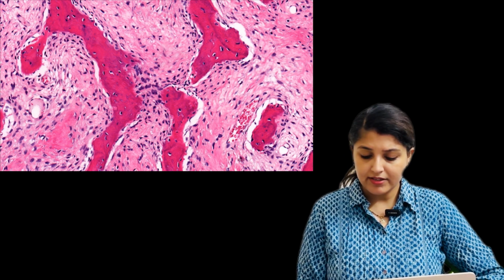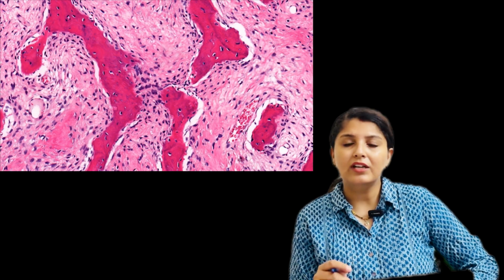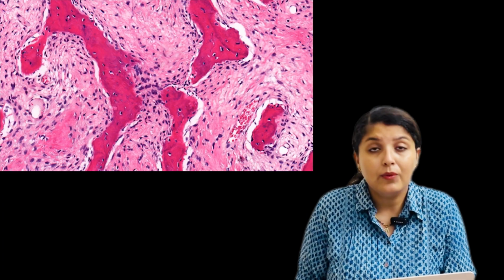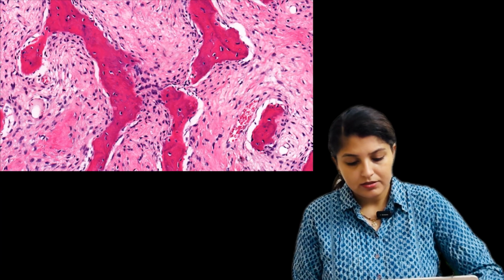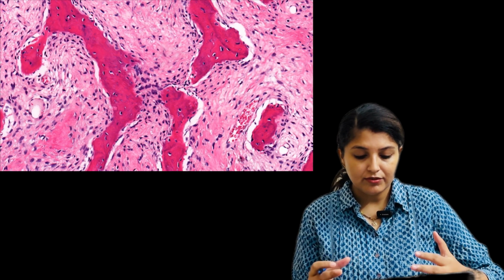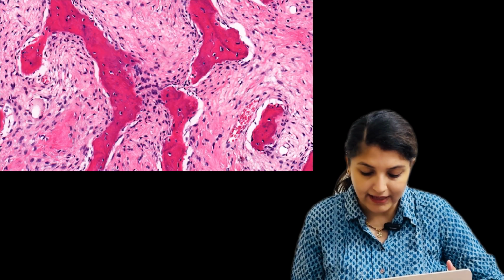Now the lesions are rich in spindle shaped fibroblasts. We have already discussed this with swirled appearance. Okay, one more thing we need to keep in mind: the fibroblasts will be seen in a swirled appearance within the marrow spaces. Fine. Now coming to the hallmark histological features, a cellular proliferation of bland uniform fibroblast-like spindle cells arranged in swirling or storiform pattern will be present.